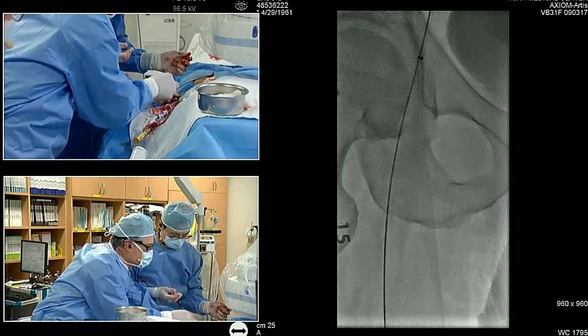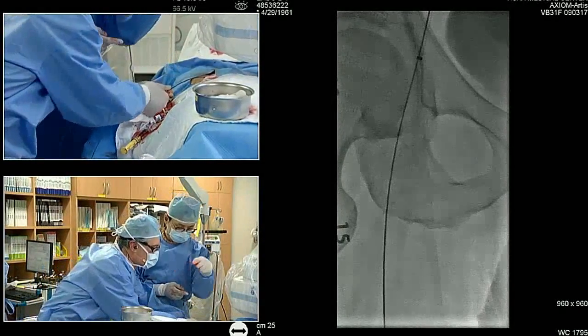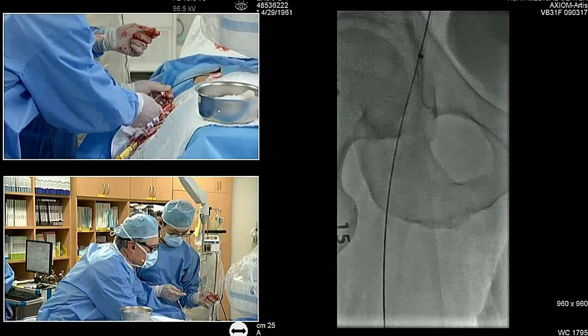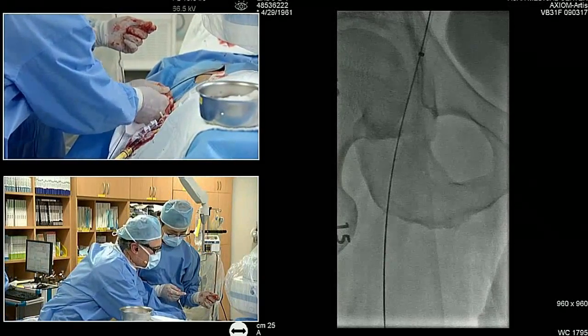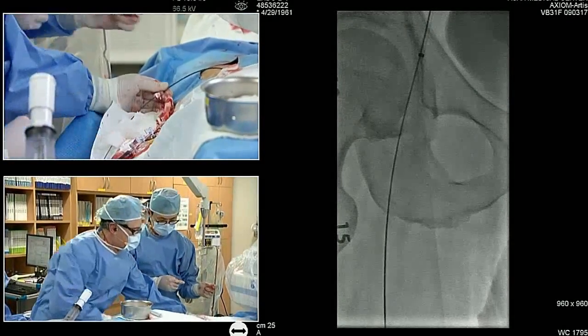Now, loading this is a little bit of a challenge here because it's an Ansel with a valve rather than a TUI. So there it goes. Hopefully it won't scrape too much. Yeah. Okay. You can continue.